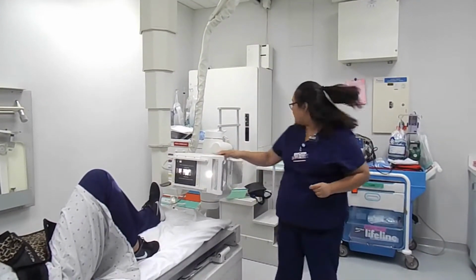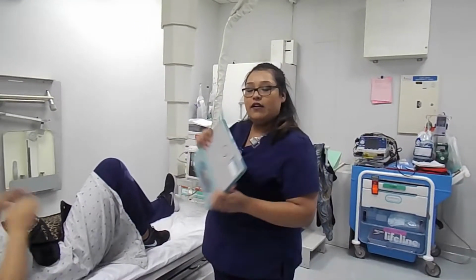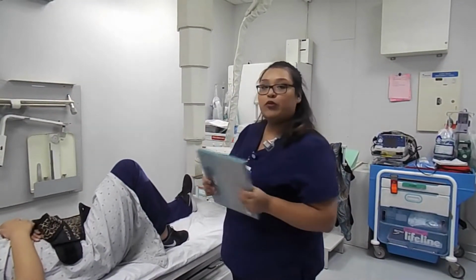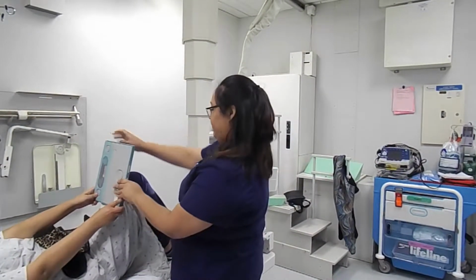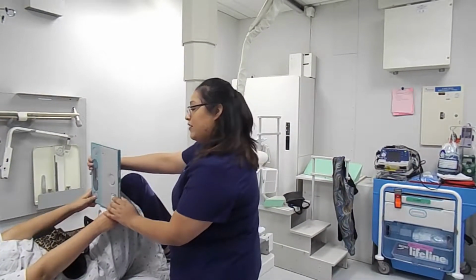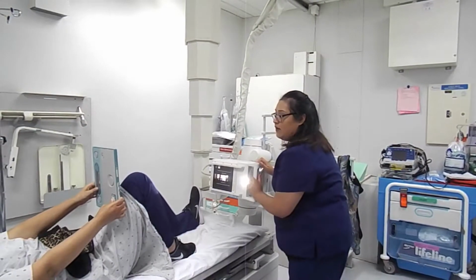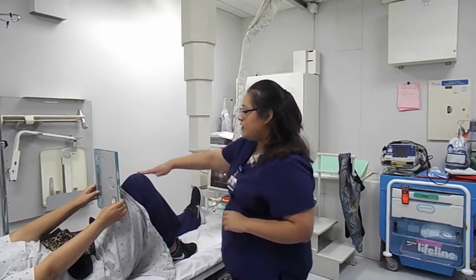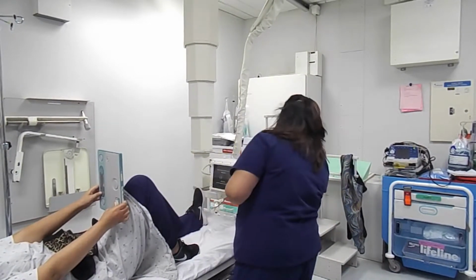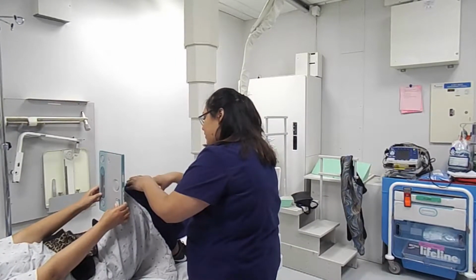And I'm going to be asking my patient to hold up the IR, and I'm going to be using a portrait orientation. Go ahead and hold this for me. Thank you. And the goal is to have the patella perpendicular to the IR. I'm just going to make sure to get them nice and even.